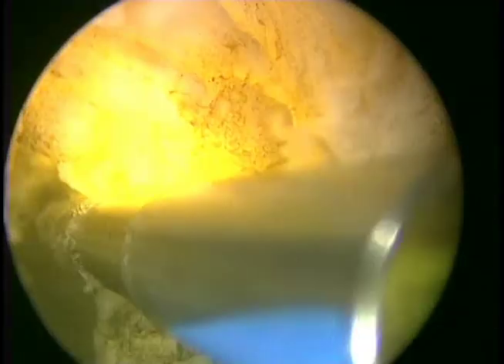Repetitious passes over the same 1 o'clock area are required at the same angle and same direction until we start seeing the surgical capsule, after which we'll start pointing our laser more toward 2 and 3 and then toward 4 o'clock to start becoming the tangent of the capsule to remove the tissue off the capsule. In essence, an enucleation-like technique.